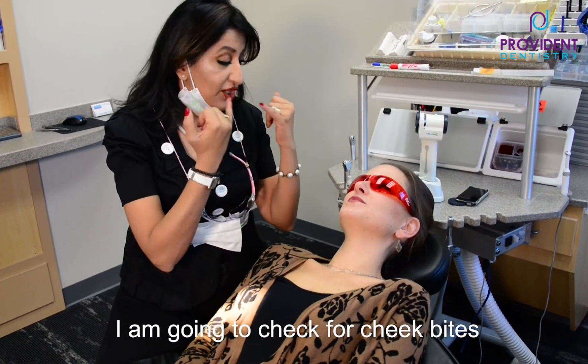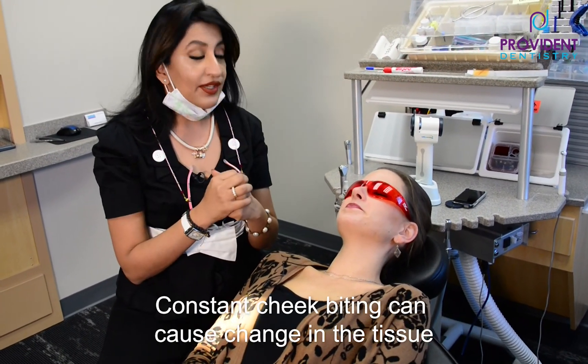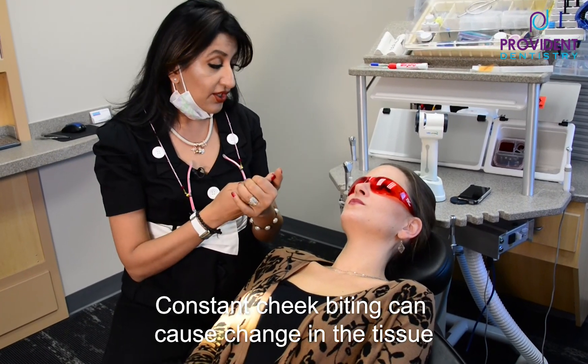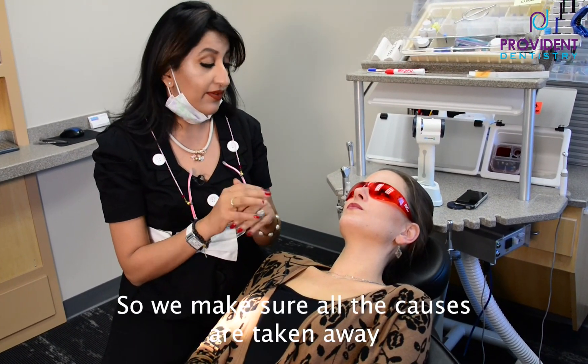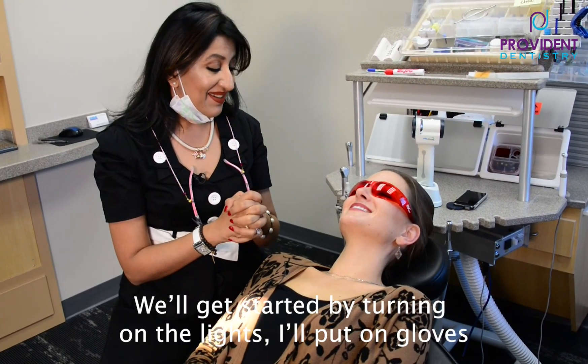What I'm going to do is definitely check inside your mouth to make sure you don't have any cheek bites, because constant cheek biting can cause changes in the tissue. Changes in the tissue can cause cancer in the future. But we always have to make sure that all the causes are taken away.